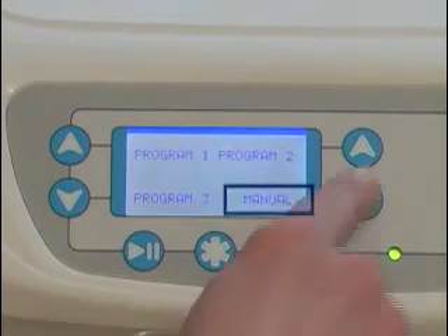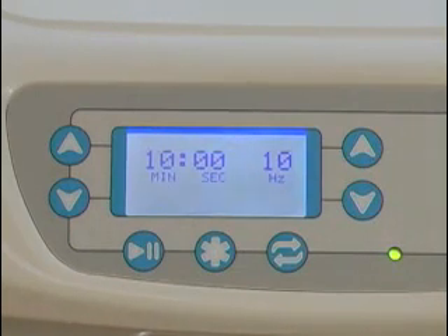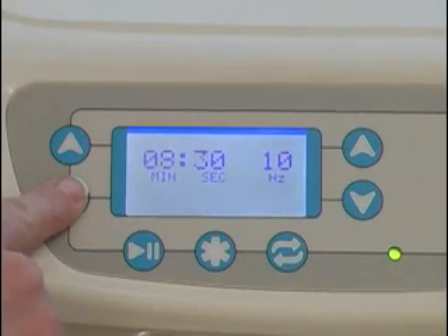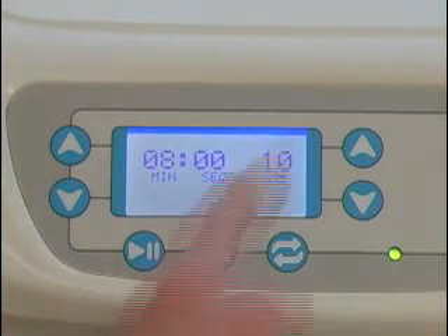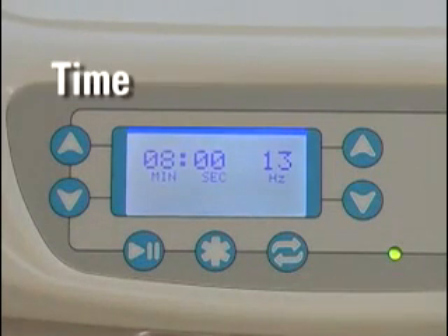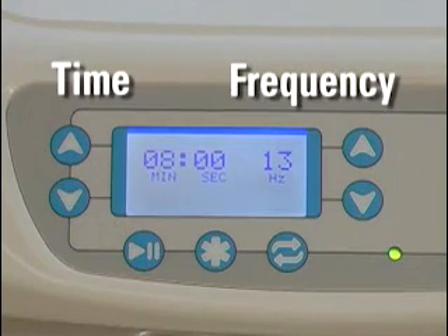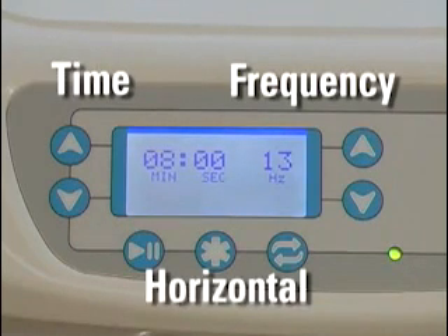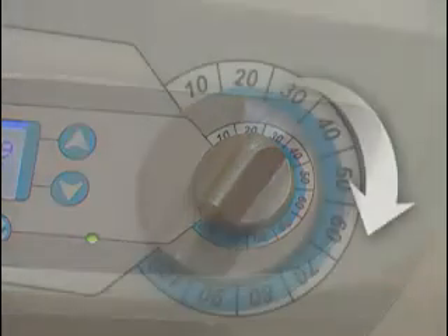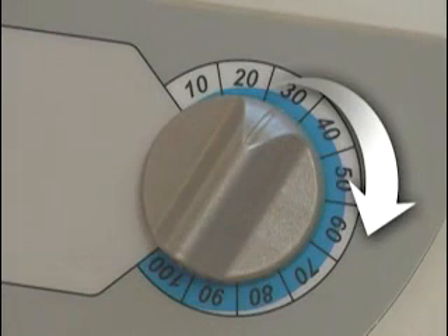Begin by pressing the down arrow next to the word Manual on the screen. The Manual Mode screen automatically displays a treatment segment of 10 minutes and 10 hertz when it comes up. Set your treatment time by pressing the up or down arrow to the left of the display. Use the up and down arrows to the right of the display to change the pulse frequency. Please note that time settings will always be to the left of the display and frequency settings will always be to the right, regardless of whether the generator is horizontal or upright. The pressure setting relates to the level of hug you will experience from the vest during treatment. Use the pressure dial on the control panel to adjust the pressure to the setting that has been recommended.